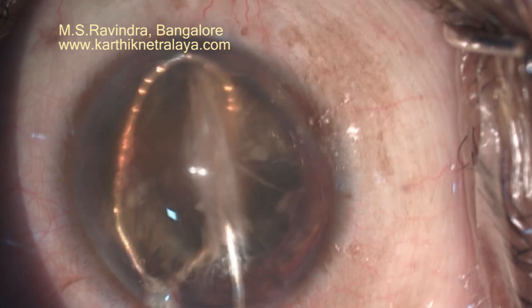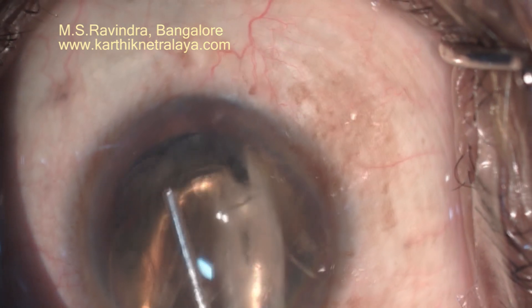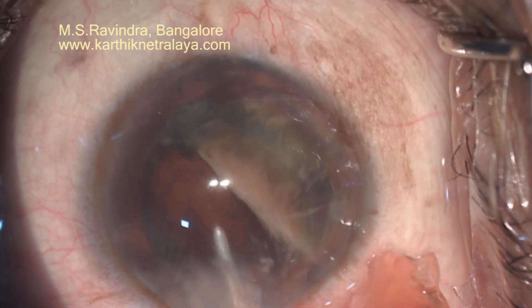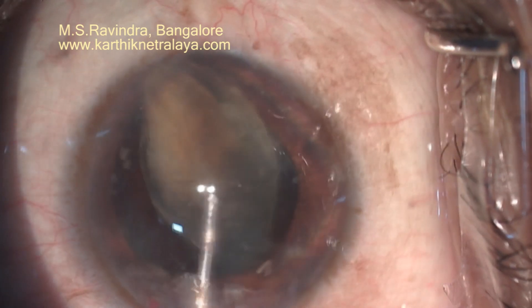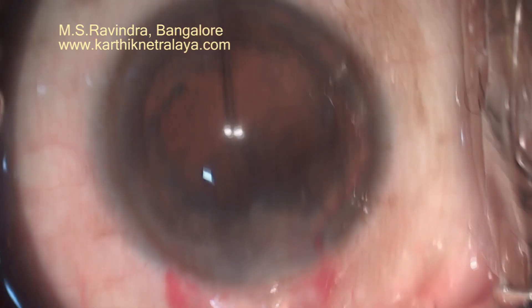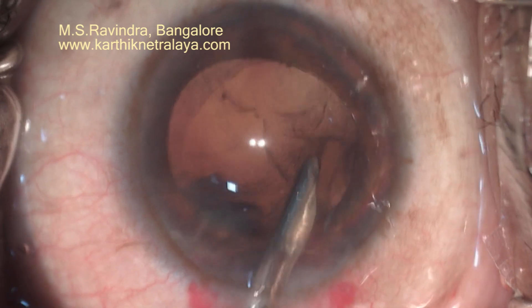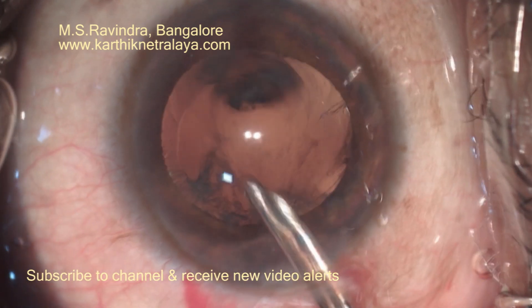Separate the two hemispheres completely. Even if a small portion is still attached, the second half of the nucleus will get dragged and will rub on the endothelium. Bits and pieces of cortex are let out to the anterior chamber by opening it up and keeping the cannula parallel to the corneal dome while injecting viscoelastic. If you keep the cannula right in the center of the tunnel, it opens up maximally, allowing larger pieces to flow out as you're injecting viscoelastic into the eye. Then aspirate the cortex.